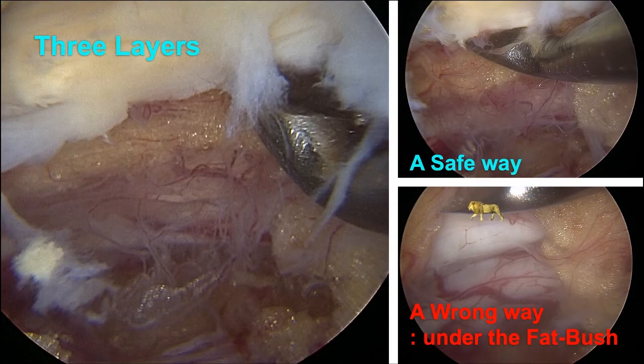There is a central dural folding under the epidural fat layer. So when you put any instrument deeply into the contralateral side under the fat layer, you can injure the central dural folding directly. Always be careful of this central dural folding in the midline.